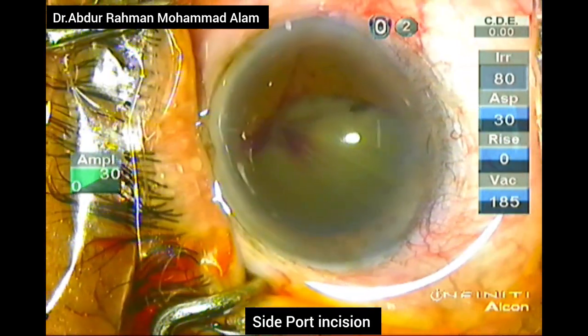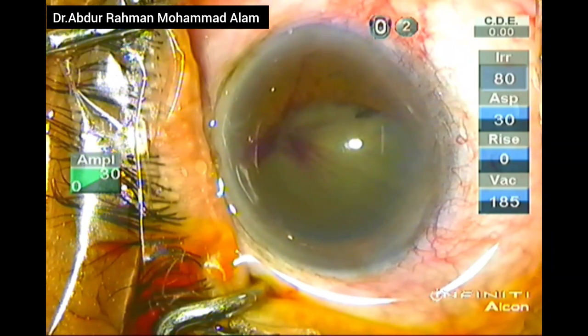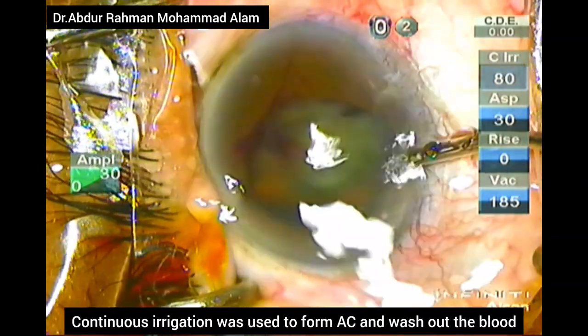Assalamualaikum, welcome to today's cataract surgery inside video. I am Dr. Abdurrahman Mohamad Alk. This is a case where a man is suffering from posterior synechia with complicated cataract.